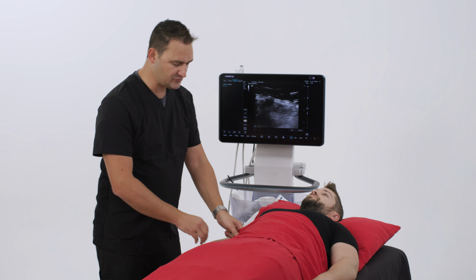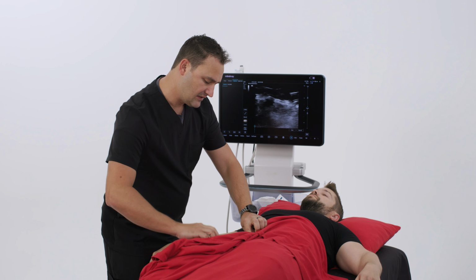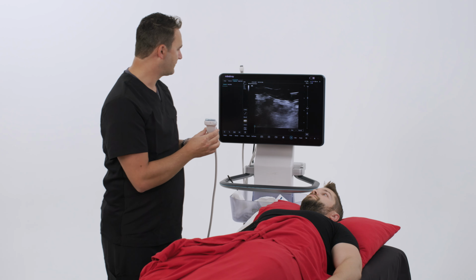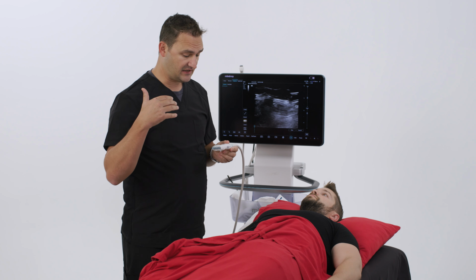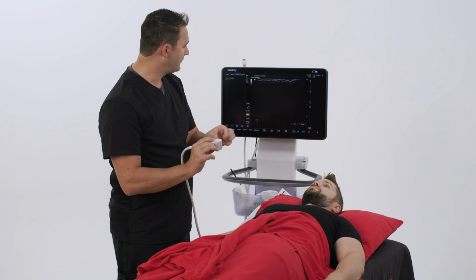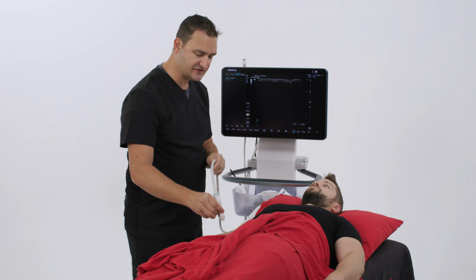Once you have your patient in the supine position, we're going to expose the area that we're going to be working on here, and I'm going to use a linear probe. This is a high frequency linear probe for this, and home base for this is going to be starting at the femoral nerve block, which is generally just caudad to the inguinal ligament. On the ultrasound probe here, you're going to notice that the right side is going to be medial, the left side is going to be lateral.